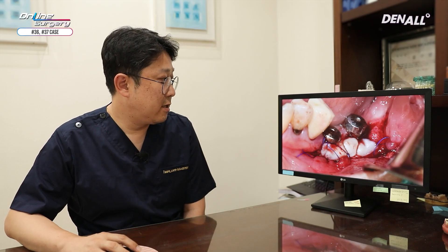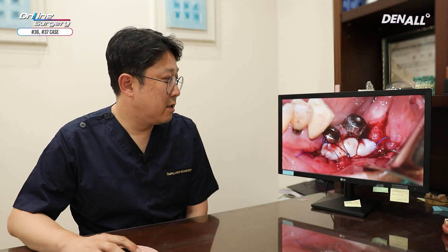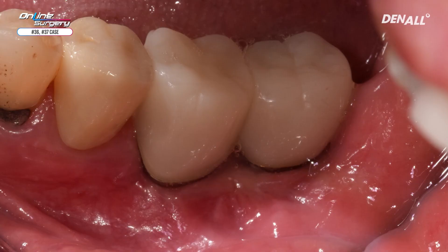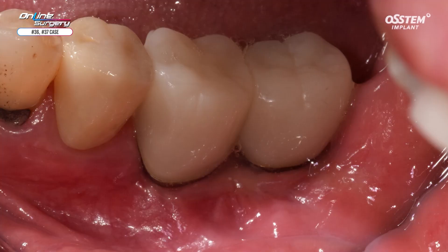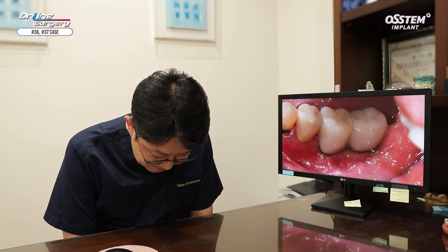About two months after implant placement, FGG was performed to secure keratinized tissue on the buccal side. As the bite was low, the final prosthesis was not yet delivered and temporary teeth are currently being used. Some keratinized tissues were created on the buccal side, and the patient can eat without discomfort. This concludes the case description and I'll come back with another case. Thank you.